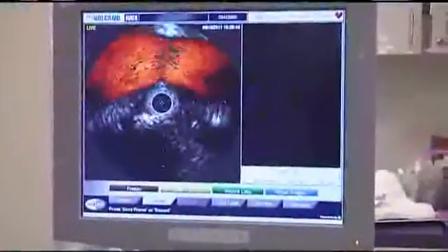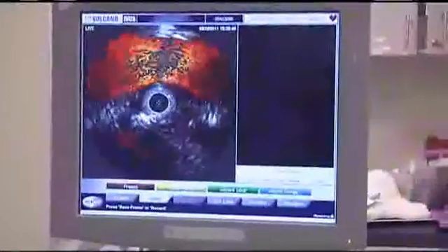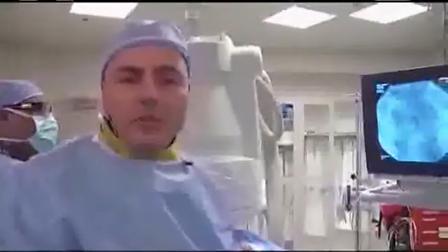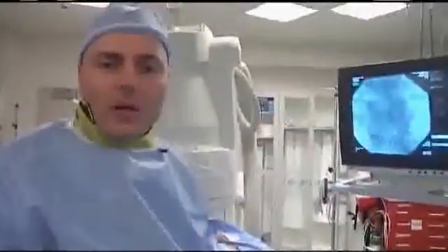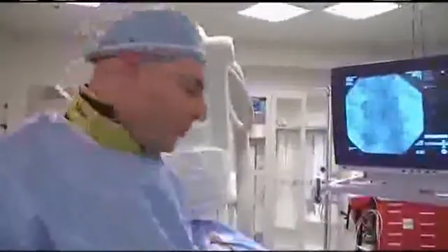I'm going to add an O14 wire at the tail end of the pioneer, which is going to be the wire of choice that re-enters into the lumen. Advance the needle — now I'm going to advance the wire. The wire has exited the needle into the true lumen. We have our initial wire, which is sub-intimal and outside the lumen. Through our distal port, we entered the new O14 wire. We're going to pull out the wire that we used to take the pioneer catheter upwards. You're seeing one wire exiting the needle of the pioneer luminal into the distal aorta, and we have our initial wire which is sub-intimal.